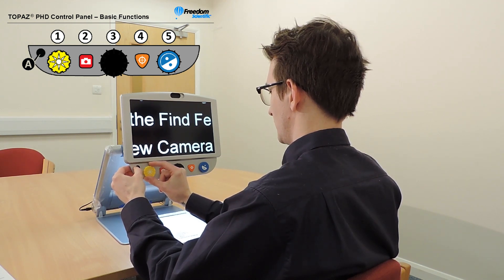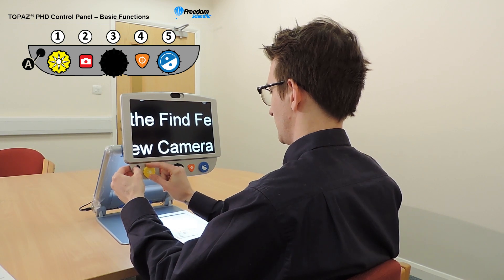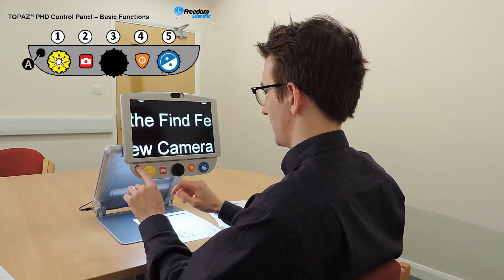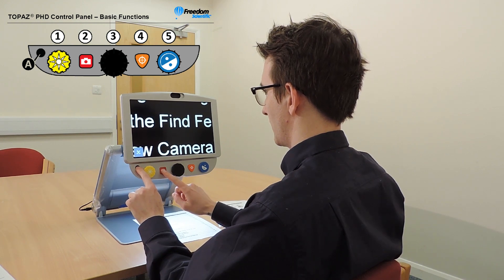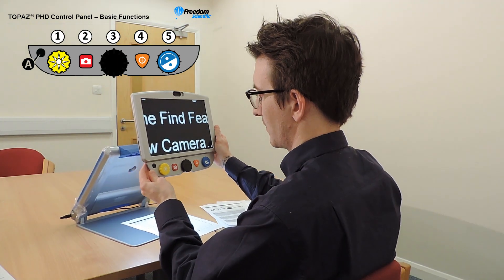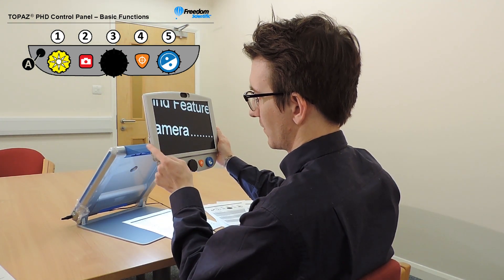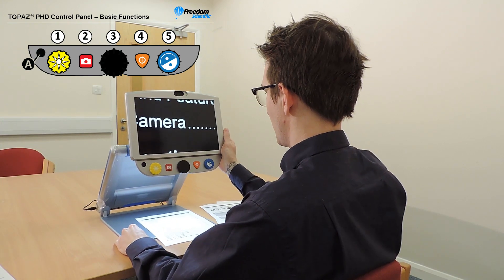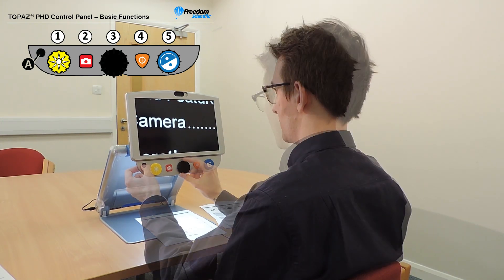To change the LED reading light brightness, use the advanced key in combination with the brightness dial. Use the advanced button in combination with the red freeze frame button — press and hold to save the current image to an SD card, then release when the save icon appears on screen. Note that images can only be saved when an SD card is installed in the SD card slot, located on the left hand side of the Topaz.